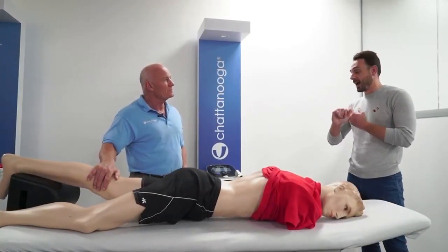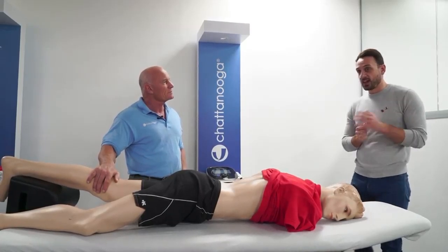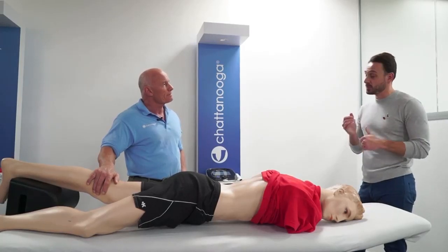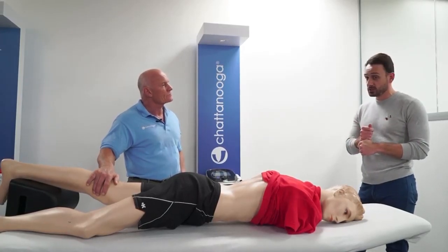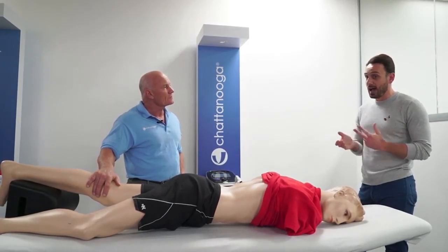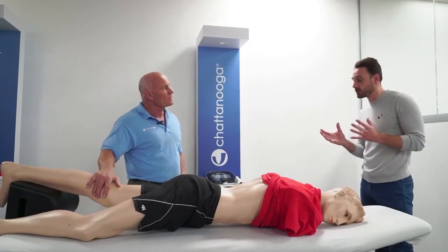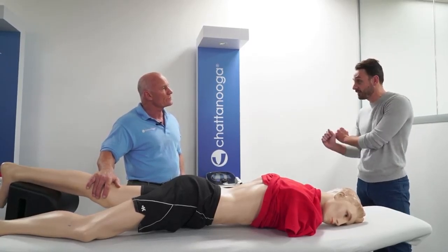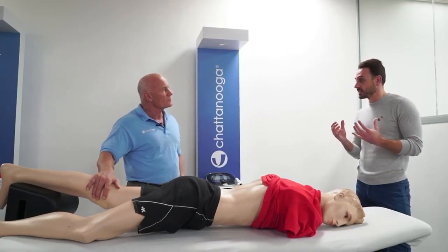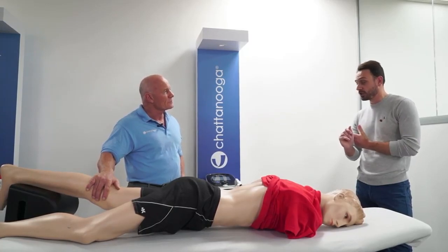In terms of their results, they found that ultrasound was significant at relieving pain for their patients, and also at improving their patients' physical function and increasing active range of motion. So their conclusions were, firstly, that ultrasound is safe, which is one of the key things to consider, but also that it's a safe treatment for relieving pain for OA patients, for improving their physical function, and for helping with their range of motion as well. So it's really, really promising results.